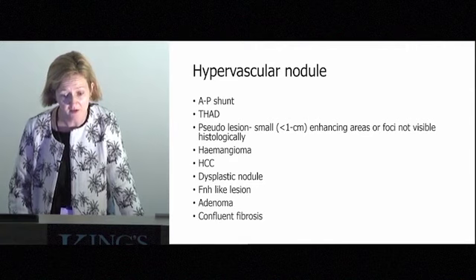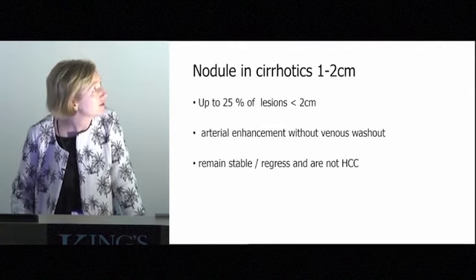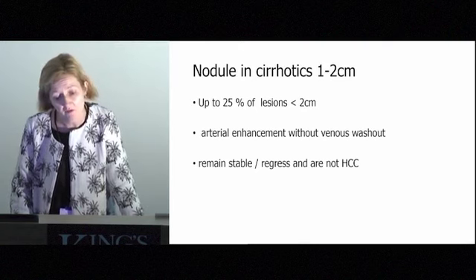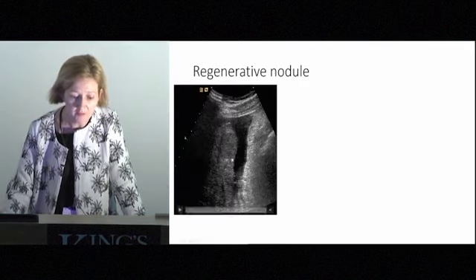So a hypervascular nodule does not necessarily mean a HCC. And in one study, up to 25% of these lesions regressed. So we have to maybe not biopsy everything and keep a close eye on them as they come along.